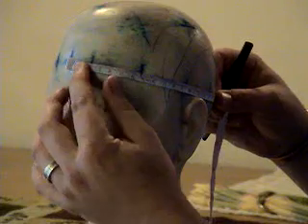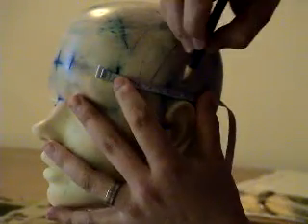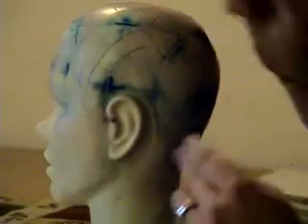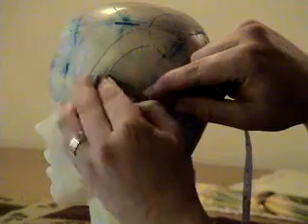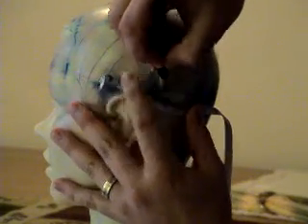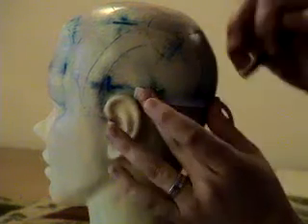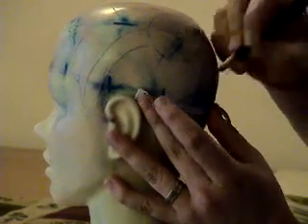and you can actually slide the tape over, and from that mark make another one, 4.6, and again 4.6, and back here 4.6. The only marks that you can assume on the head is an imaginary line all the way around.